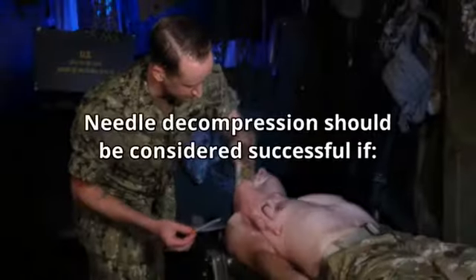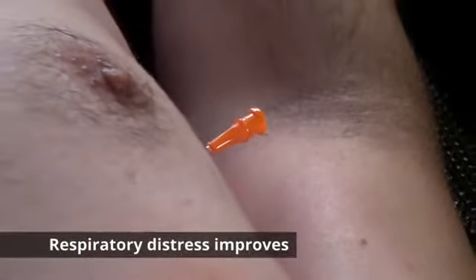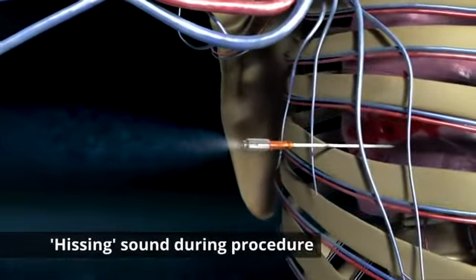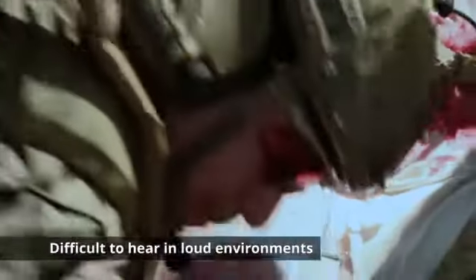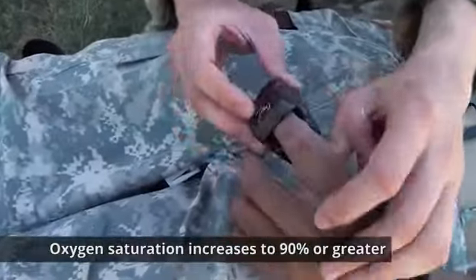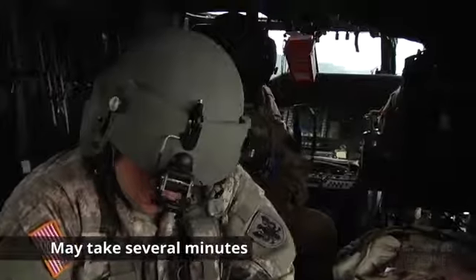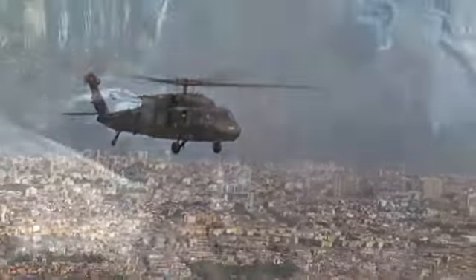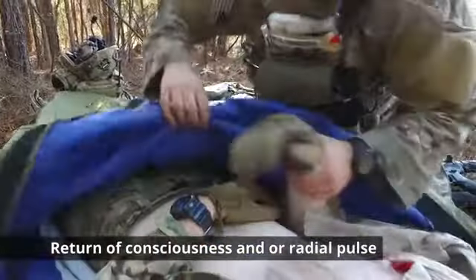The NDC should be considered successful if respiratory distress improves or there is an obvious hissing sound as air escapes from the chest when NDC is performed. This may be difficult to appreciate in high noise environments, or hemoglobin oxygen saturation increases to 90% or greater. Note that this may take several minutes and may not happen at altitude, or a casualty with no vital signs has returned to consciousness and/or radial pulse.